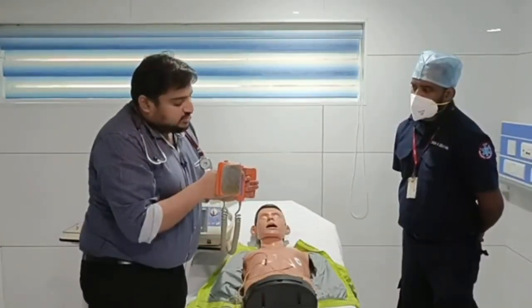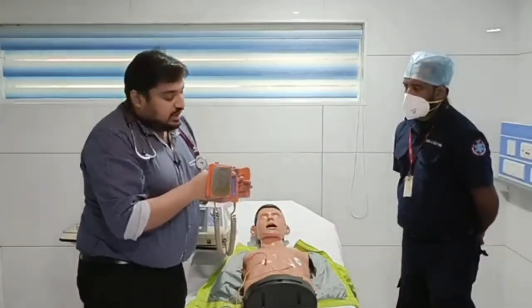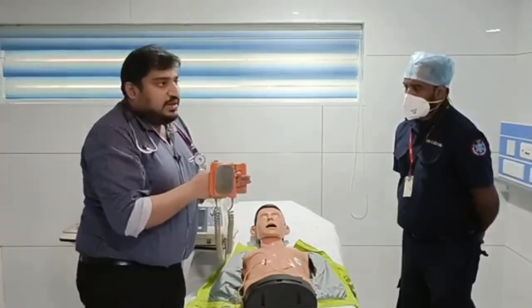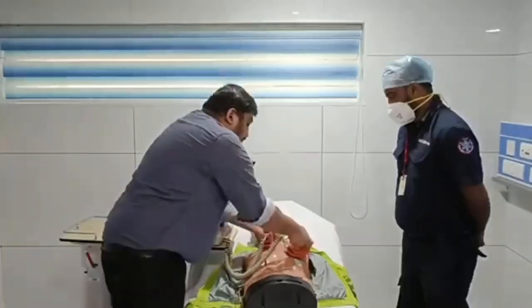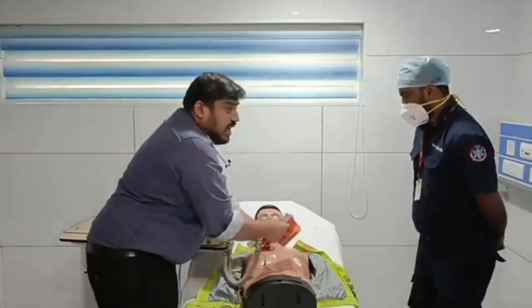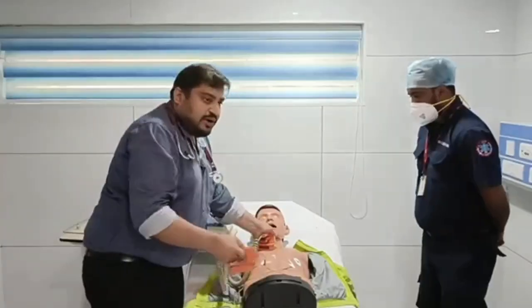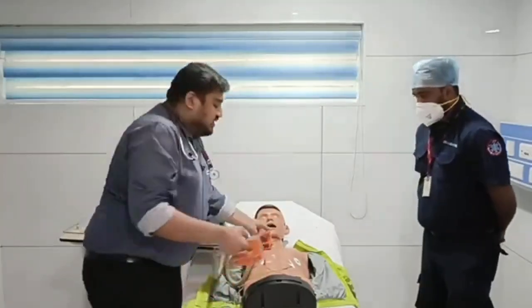If the contact is good, the light will come to the top, it will be green. If it is not good, it will be red here. So these are the light indicators that you need to see, and make sure that you are having adequate contact, and shout out loud that I am clear, everybody clear, and nobody should be touching the patient at that point, and possibly stop the oxygen source.